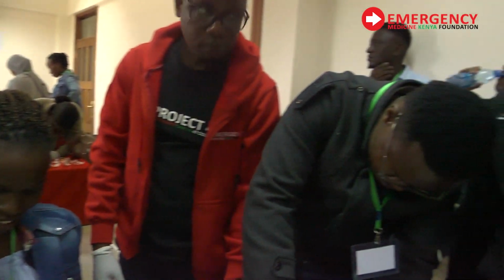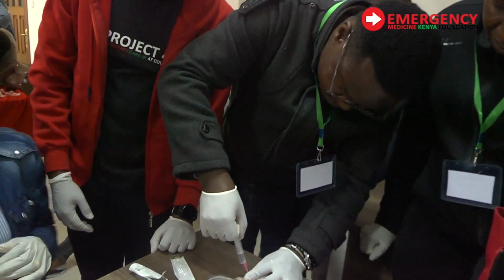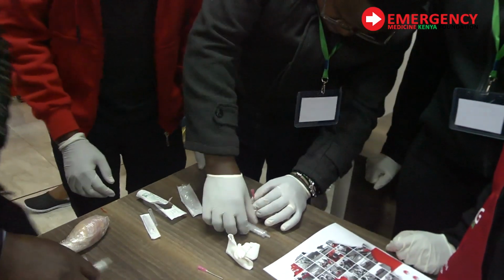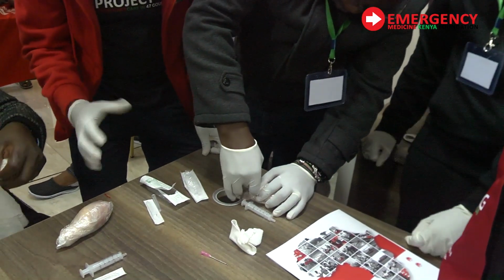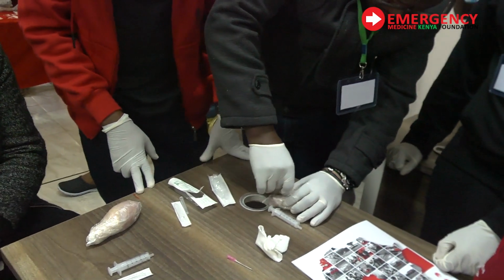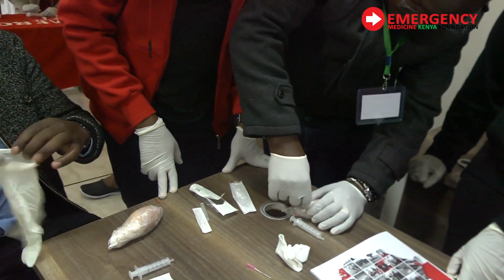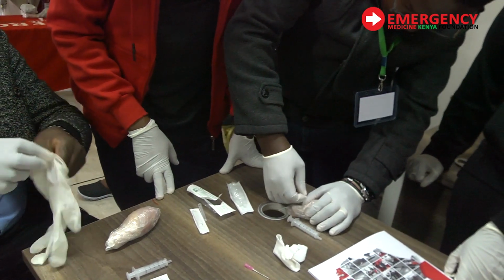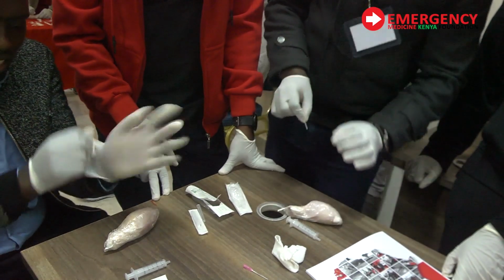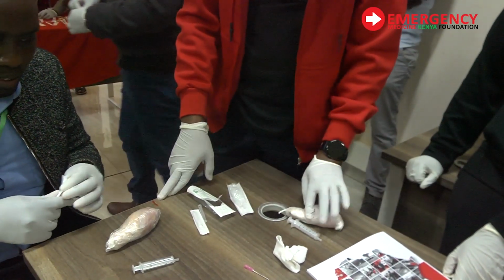But yes, sometimes you'll get a patient who has an above knee amputation. There is not that part. Will you say you can't do an intraosseous? You'll pick a bone that is above. You don't have an IV access. The patient has bilateral amputation, or has come with a bad degloving injury on the knee. So what do you do? You can do the iliac crest, the head of humerus, the clavicle, or the sternum.